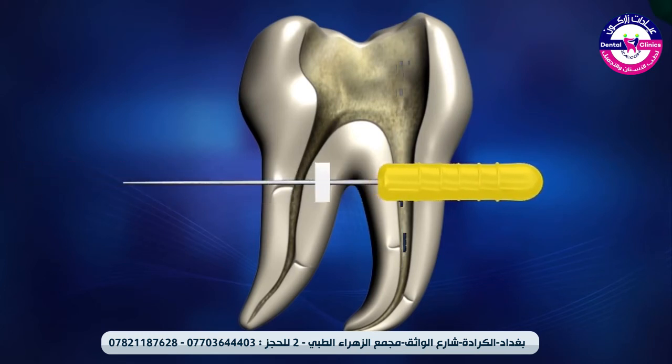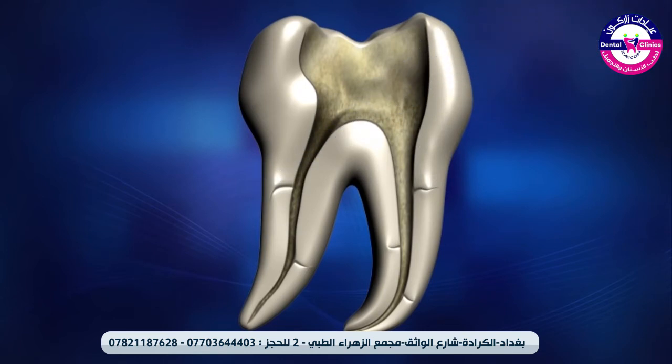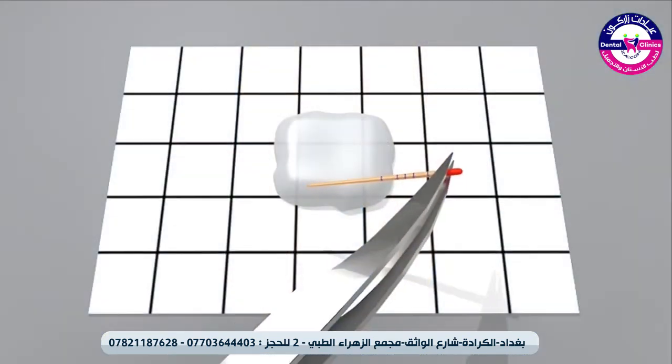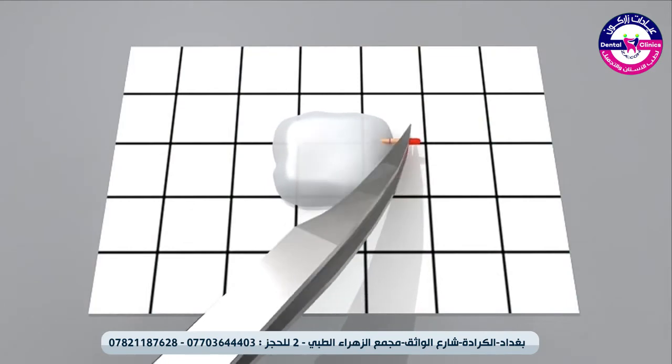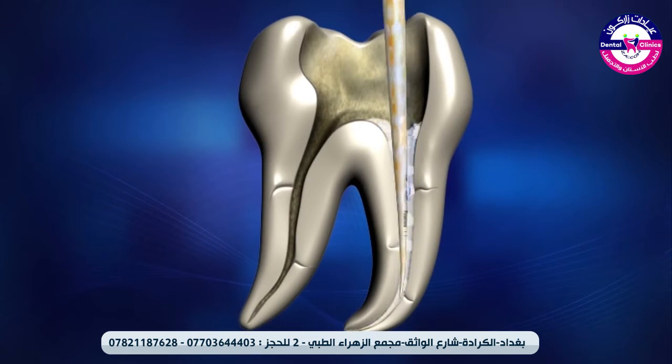To select an appropriate size for the hand plugger, insert the hand plugger and match it to the Dia-Pen tip size. Coat the fitted master cone with sealer and insert the cone repeatedly into the canal 2 to 3 times. This will help eliminate any gaps between the gutta percha and the surface of the canal.